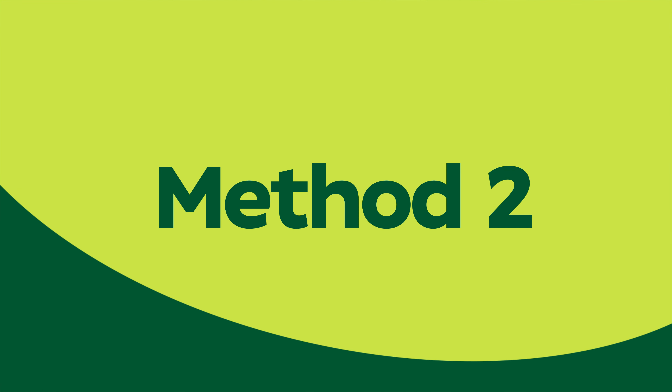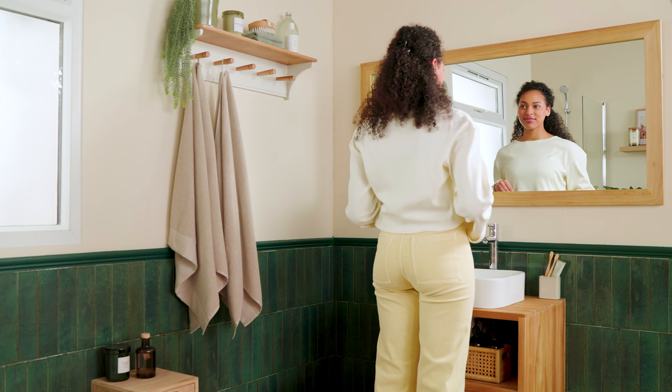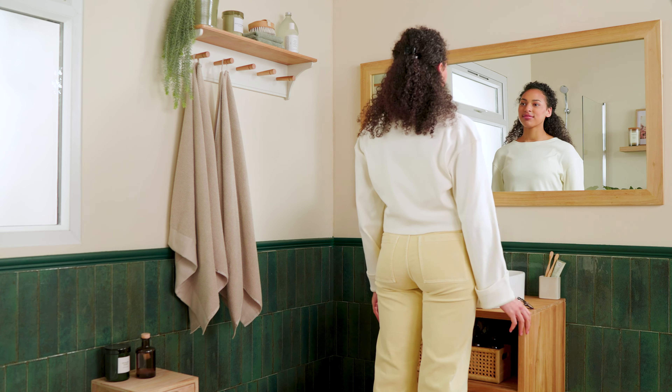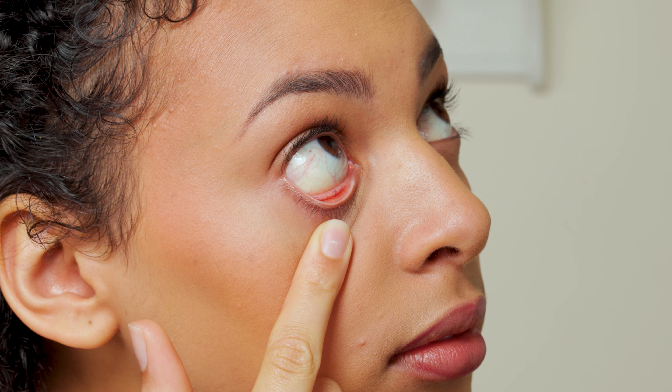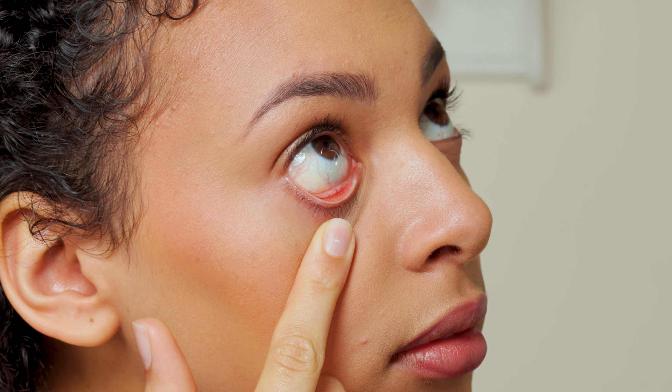Method 2. If you'd prefer to try it another way, this method might work for you. Hold the lower eyelid down with your other hand. Move your finger towards your eye, but stop before it touches. Look up and place the contact lens onto the white of your eye. Then remove your finger, still holding onto your eyelid. Look around to remove air bubbles. Release eyelids slowly and blink a few times.